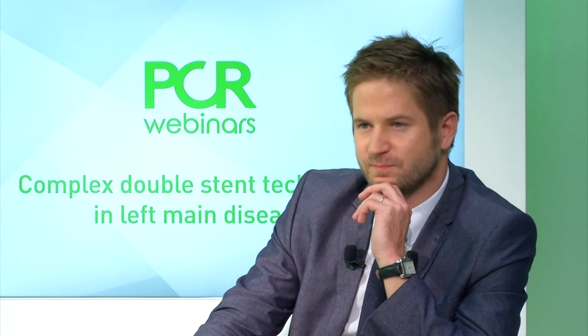The second possibility would be that you say we do provisional first, and then let's look at the ostium of the circumflex. How is it? And maybe we can keep it with 1 stent. Okay, just to summarize then, first left main LAD, the main branch, without most probably too high a risk of losing the circ, and hoping that maybe you can solve it with 1 stent. Agreed. Marco? That's exactly what I was thinking.